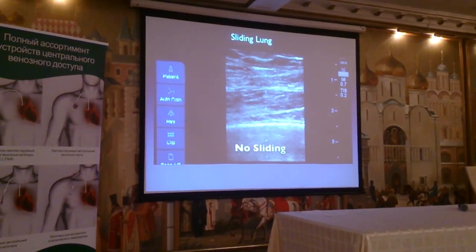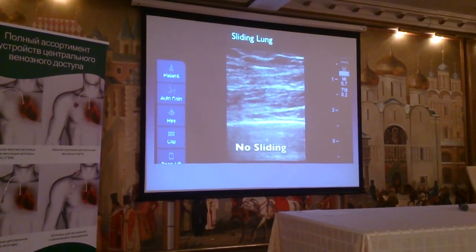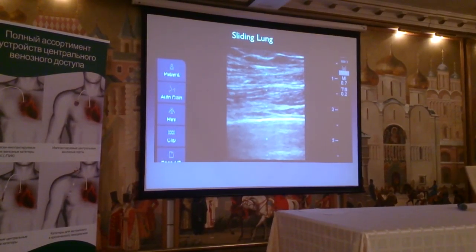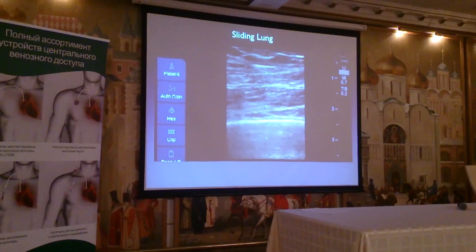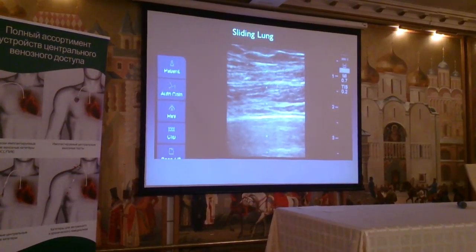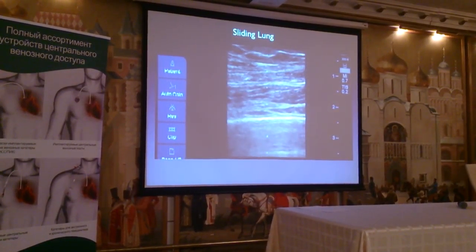In contradistinction to patients that have a positive sliding lung sign, some patients with severe pulmonary disease or pneumothorax will not exhibit a positive sliding lung sign. This is an example of what absent lung sliding looks like, and here is an x-ray to explain why it doesn't show a sliding sign.